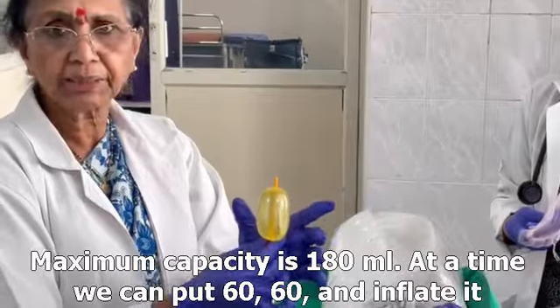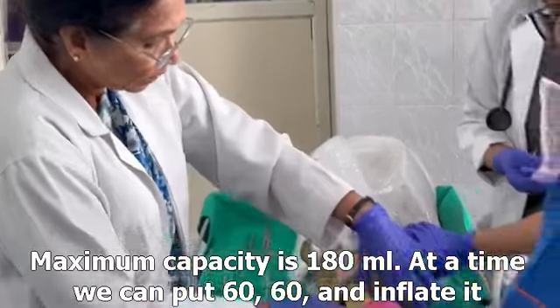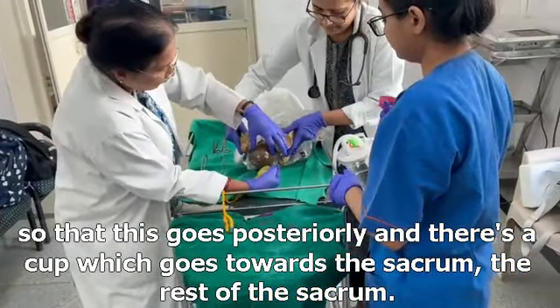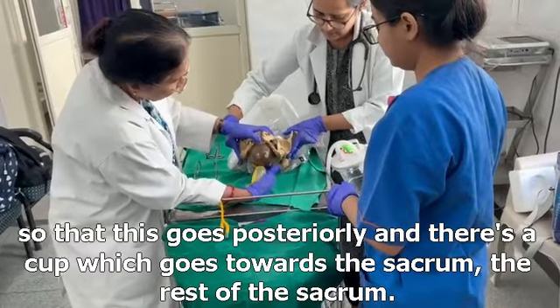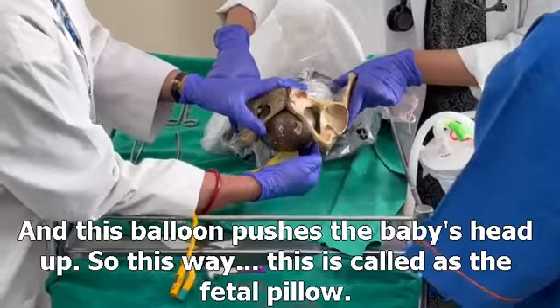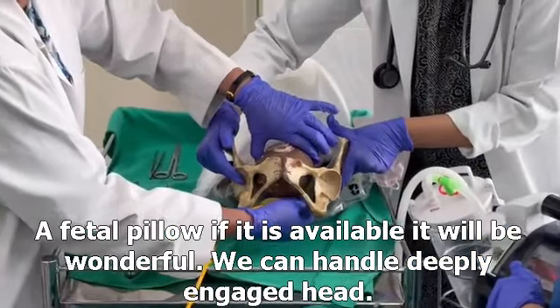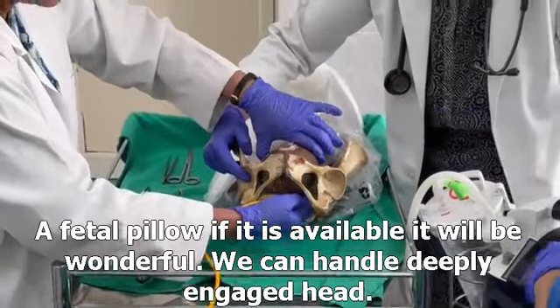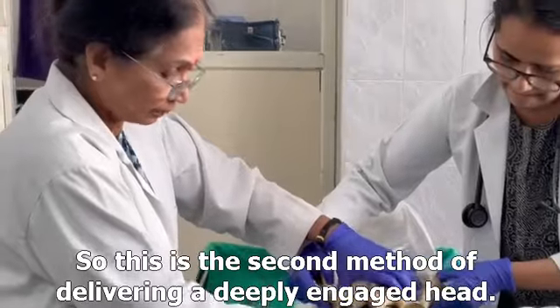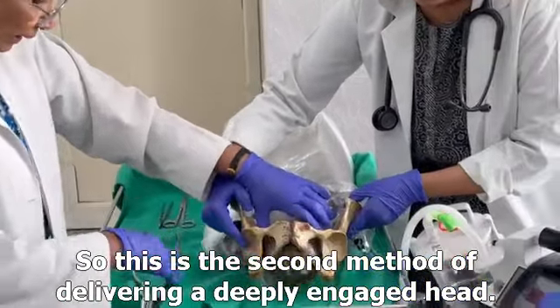Maximum capacity is 180 ml. At a time you can put 60 and inflate it so that this goes posteriorly, and there is a cup which goes towards the sacrum. It rests on the sacrum, and this balloon pushes the baby's head up. So this way, this is called the fetal pillow. If a fetal pillow is available, it will be wonderful. We can handle a deeply engaged head. So this is the second method of delivering a deeply engaged head.